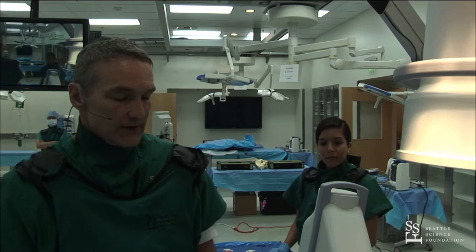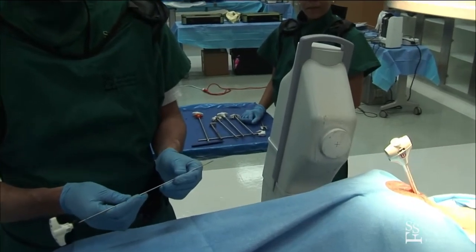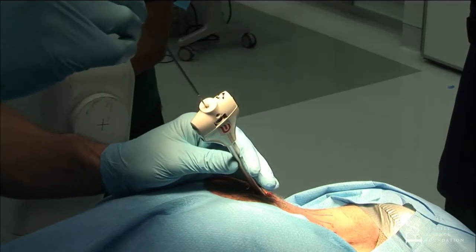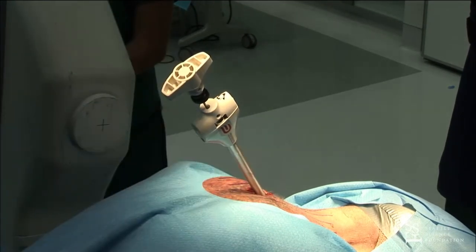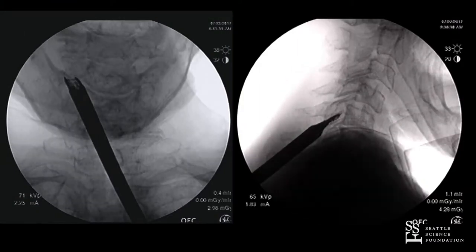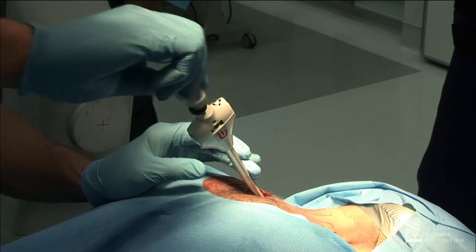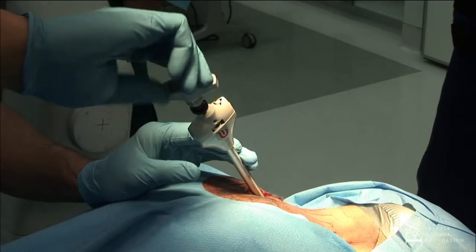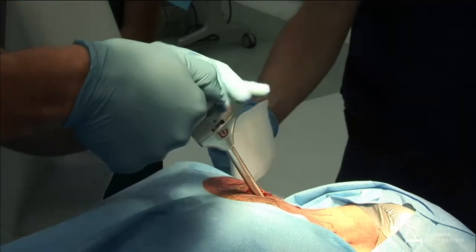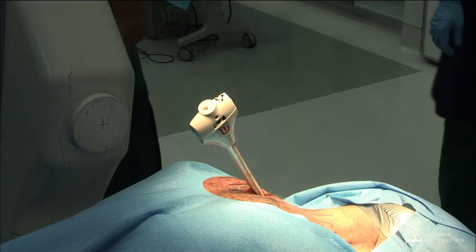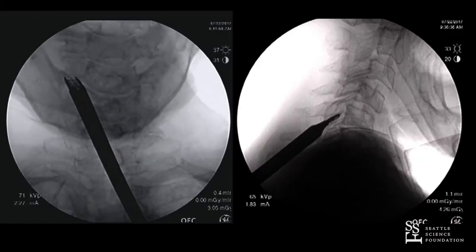So this is the supplemental screw fixation. As I said, it adds substantially to pull-out resistance and is integral to it. The technique here is a little downward pressure with the hand. Before you put this in, you want to make doubly sure, because once it's in it's a bear to get out — so check a lateral and an AP. That's a satisfactory position. A little downward pressure helps deflect the screw up. The screw is deflected by the cage — it's actually stuck to the cage, so you can never get a loose screw. This breaks off; you can hear that click.